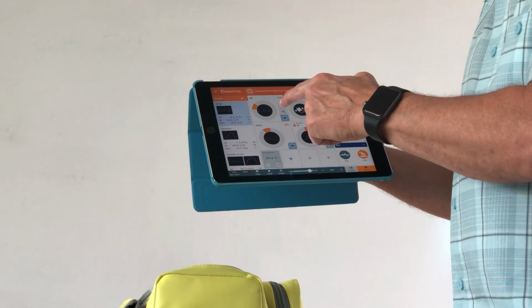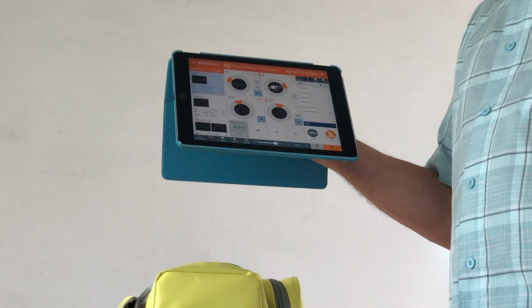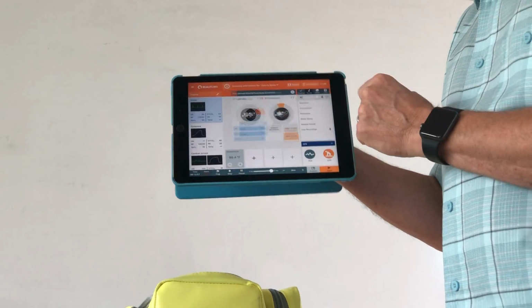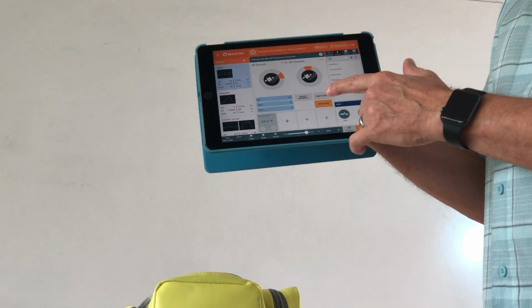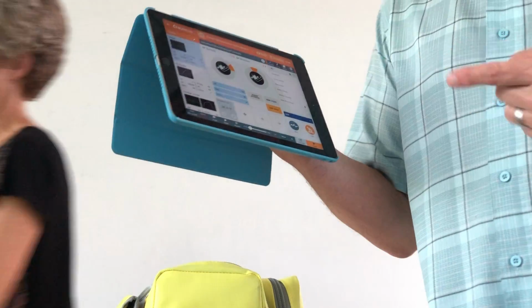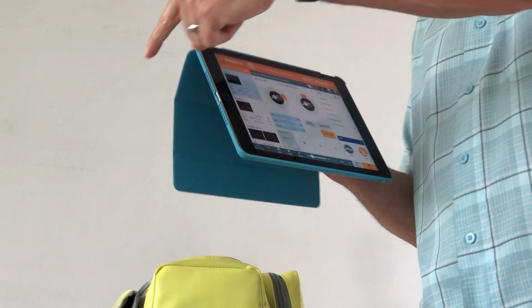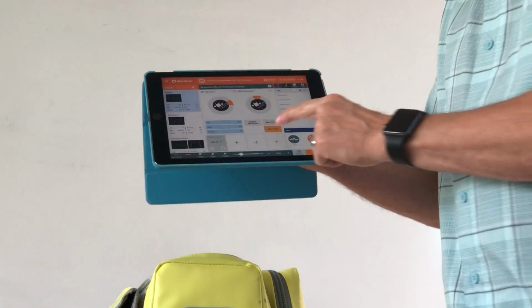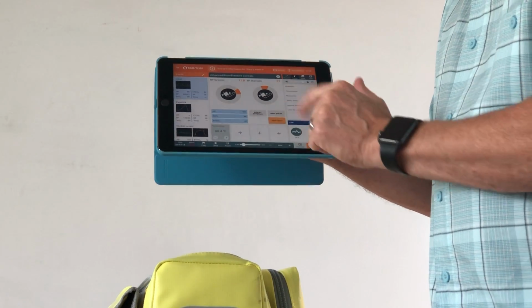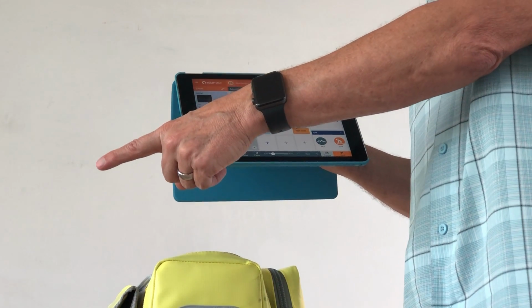The other thing that I didn't mention is a few of these boxes have little squares that you can expand. Right next to the dial, there's a little expanding square. On the blood pressure one, as an instructor, there's a NIBP send. Normally, they don't see a blood pressure unless they hook up the cuff and push the button. If something changes, if they checked it before you meant to change it, or you just want to get their attention, you can hit the NIBP send button and it will pop up the blood pressure on the screen whether they acquired one or not.